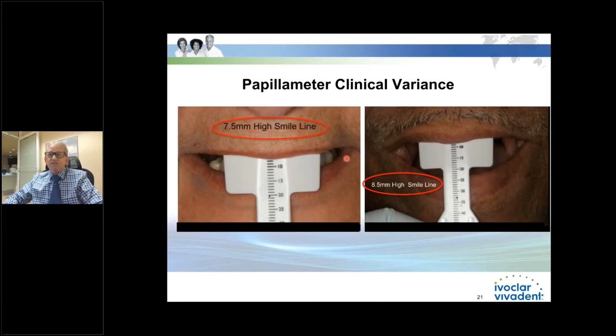When that patient smiles, if you remember, in one of the patients where we didn't have good communication, all they showed was pink. It's amazing how much tissue they showed. And that's one thing that can really trip you up when we're doing dentures: if the acrylic gets shiny and the light hits it, it's fake. Everybody a mile away knows it's a denture. So we really do not want to show as much acrylic unless we have to.